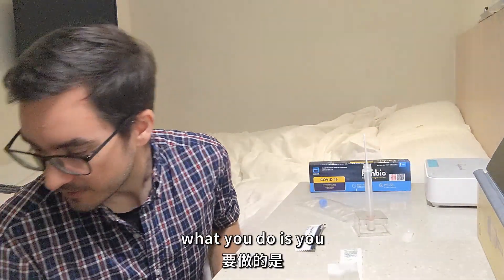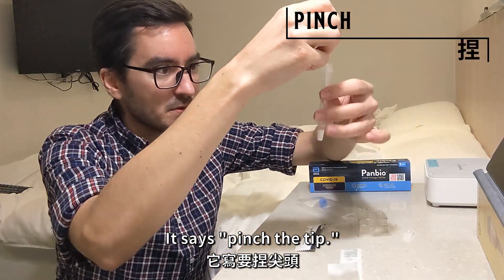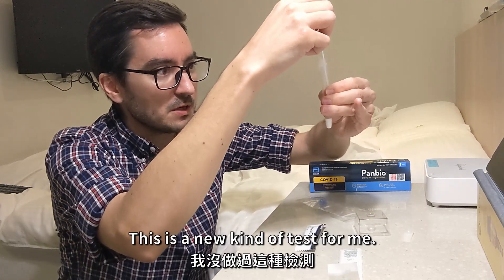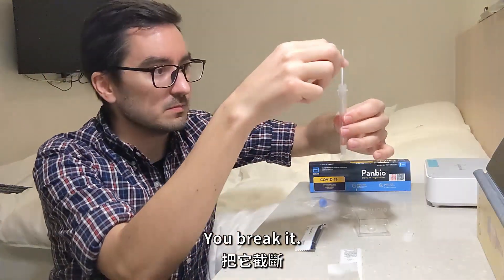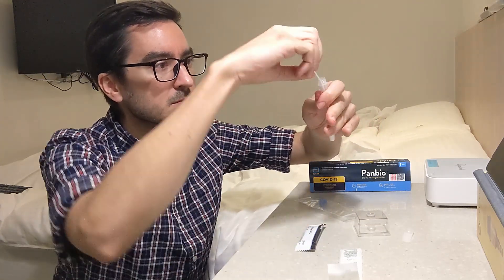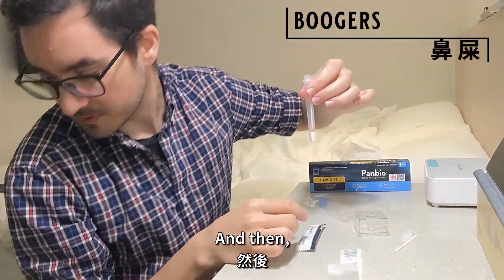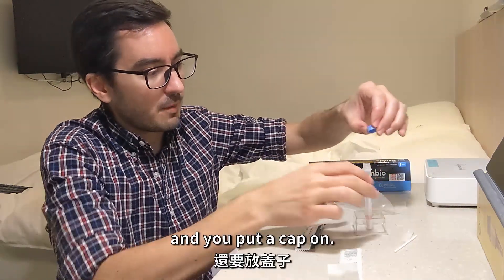Then what you do — it says pinch the tip to remove liquid, so you want to squeeze it out. This is a new kind of test for me. And then you break it. Like I said, there's a point that you can break it, so you snap it. And then we have our test tube of sample. You leave it in that little thing and put a cap on it.